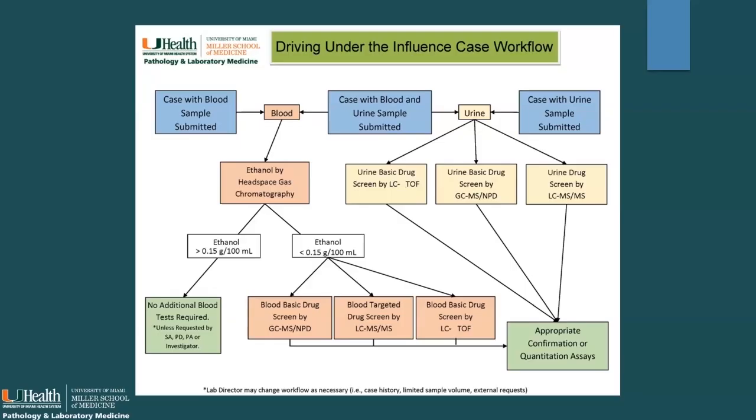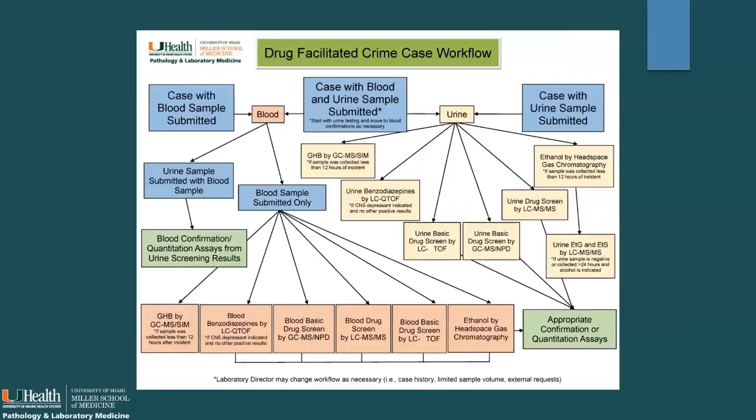But I did want to point out where we have our LC TOF screening assays. So we have for urine and blood, and these are part of our general assays that we use really for all of our samples. Then we have our drug facilitated crime case workflows.